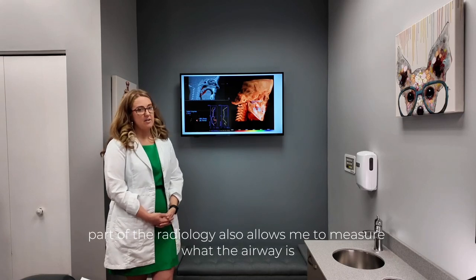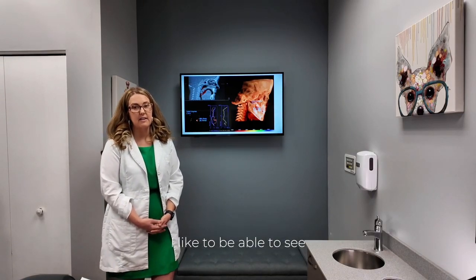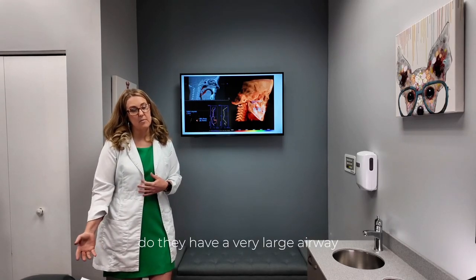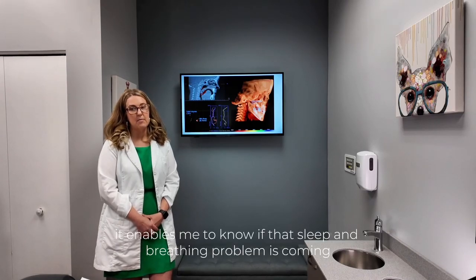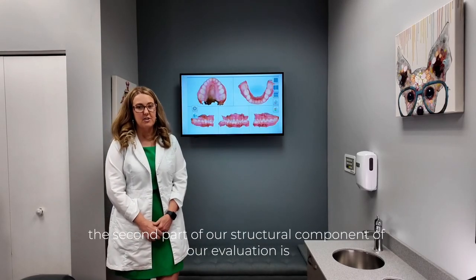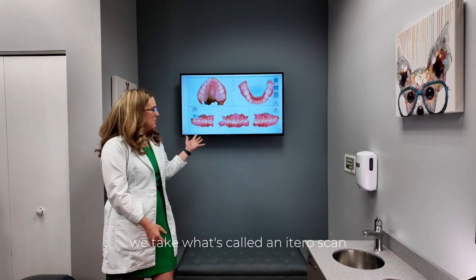Lastly, part of the radiology also allows me to measure what the airway is. I like to be able to see, does the child or the adult have a very small airway? Do they have a very large airway? It enables me to know if that sleep and breathing problem is coming because of size or because of soft tissue.